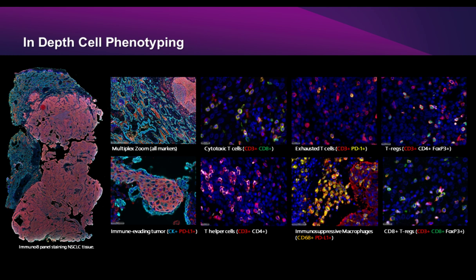As we had an earlier question about looking at the different cellular spaces, membrane, cytoplasm, nucleus: typically with cytochemistry or cell preps, those membranes can be easily disrupted, diminishing membrane signal, to get into the nuclei and stain for nuclear signal. So it is a tricky balance, and there are multiple fixation strategies that can be applied to get the best of both worlds. But I can't speak specifically on the Ultivue InSituPlex for cytochemistry itself.